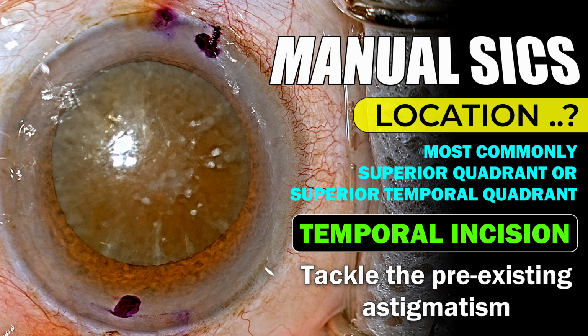So, if you're planning something like a toric lens where your surgically induced astigmatism has to be very controlled, then obviously you have to choose the temporal incision itself. And that's the reason why I'm going to do a temporal MSICS in this patient. Let's see how it is done.